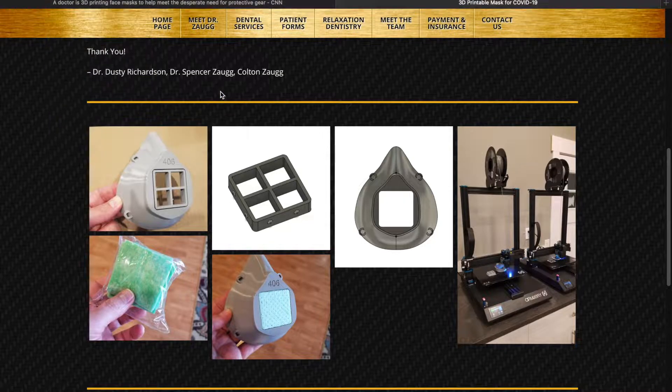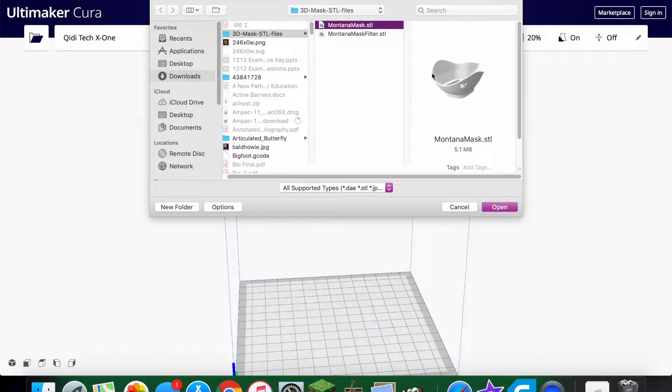Now that we have the 3D file for the mask, we have to do something called slicing for it to be readable by a 3D printer. When you slice an STL file — which is this 3D model — what it's essentially doing is converting the 3D file into code that a 3D printer can read, because the 3D printer starts at the bottom and moves up in little lines like that.